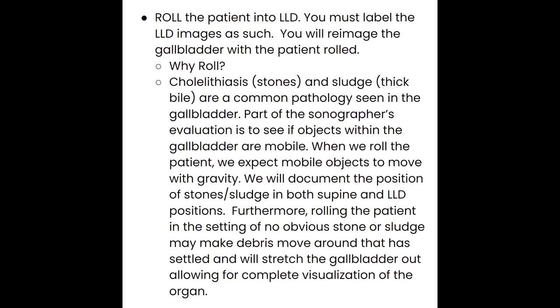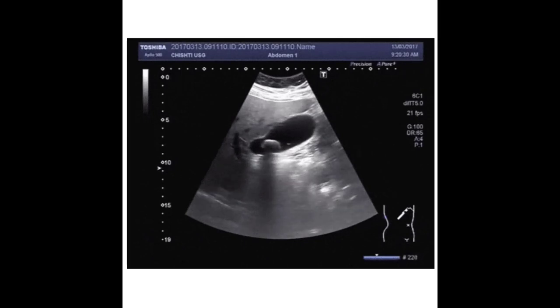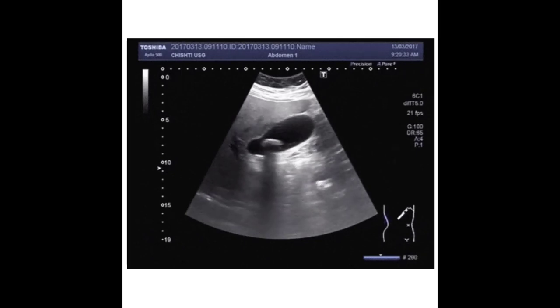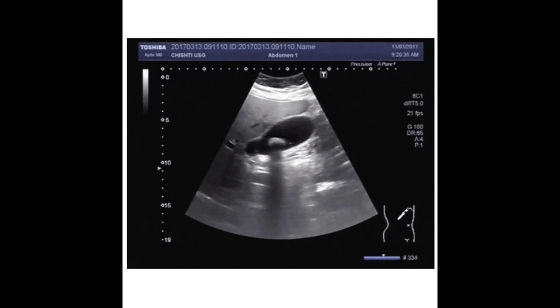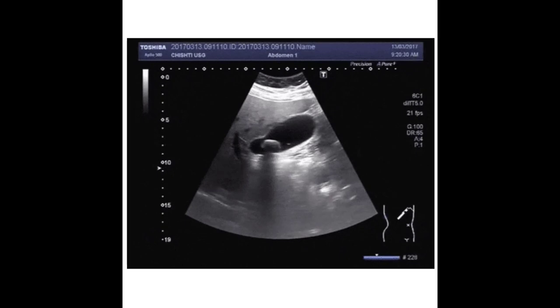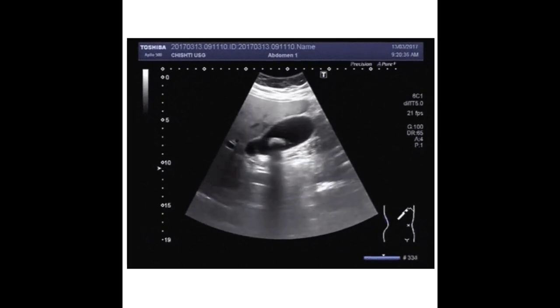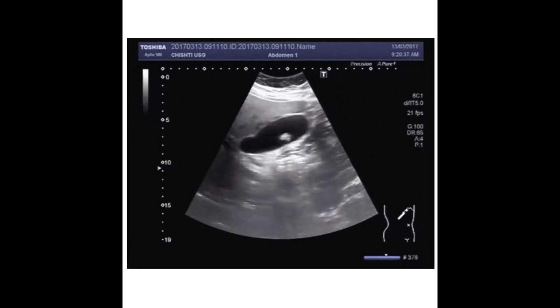If a stone is present, make sure it is not stuck in the neck by rolling the patient all the way to prone if needed, to get the stone to roll from the neck toward the fundus. Don't be afraid to move your patient around. Here we have an example of a large stone starting at the neck, and after rolling the patient, the stone moves toward the fundus.